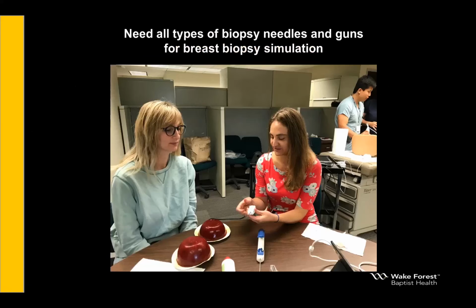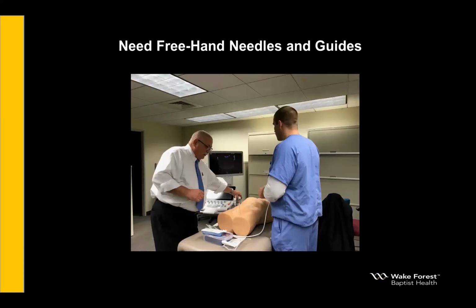You're going to really need all the different types of biopsy needles and guns that you use in your practice for simulation. This is Dr. Lee, one of our breast faculty, teaching Jordan, one of our residents, the different types of guns that we use for breast biopsy in the lab. You also need to have all the different types of freehand needles and guides. Again, the residents need to feel comfortable with the equipment in the lab before they're in front of a patient having to use the equipment.